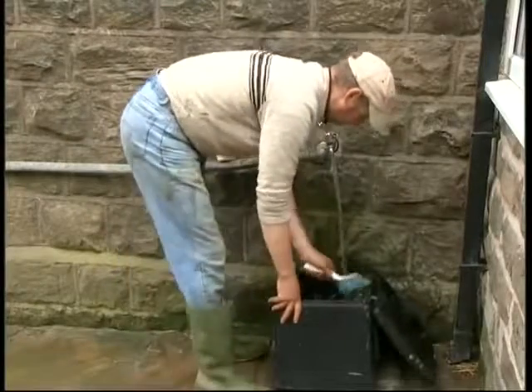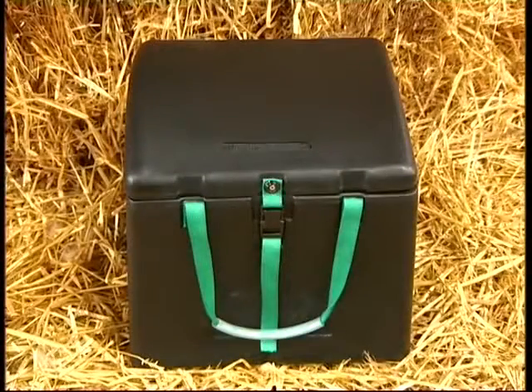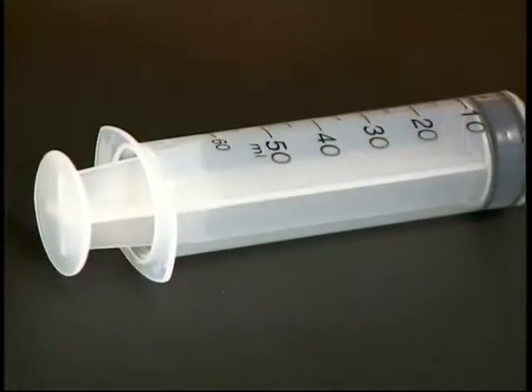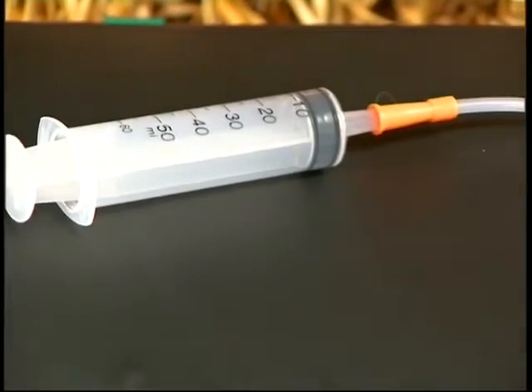The Woolly Warmer is easy to wash and then is ready for the next cold lamb. Because we realise the huge benefit of feeding weak lambs with warm colostrum, there is a tube feeding set included with your Woolly Warmer. If you are unsure how to tube feed, please seek advice from your veterinary surgeon.